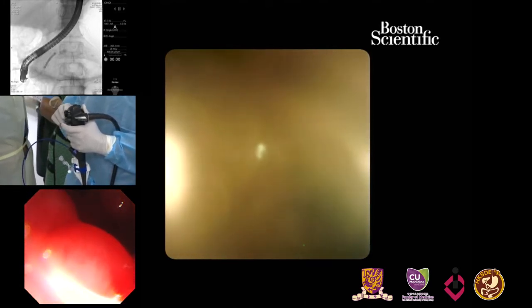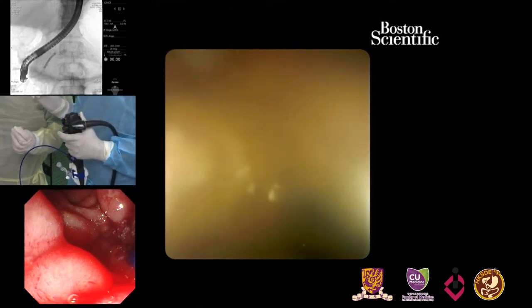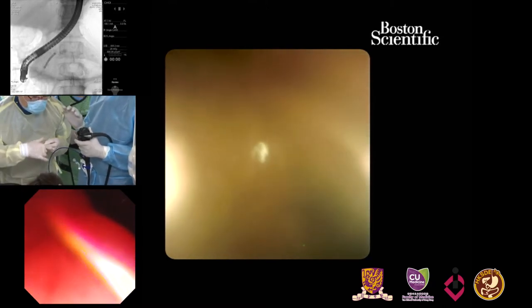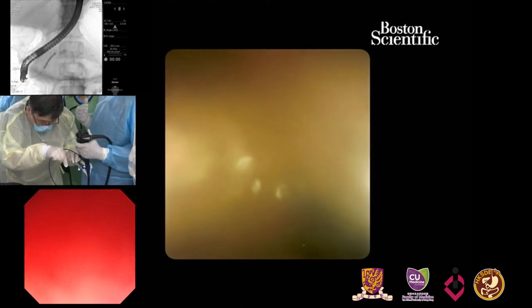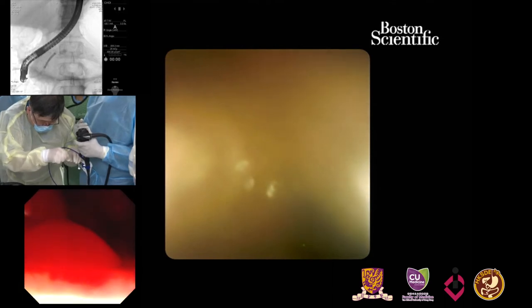So then we put the same, I'm using an angled 2.5 VisiGlide. Always for the Spy scope, use 2.5, not 3.5, because it moves much better. But I say the images are very good, and hopefully by next year they have the third version of the digital scope, which makes it much easier.